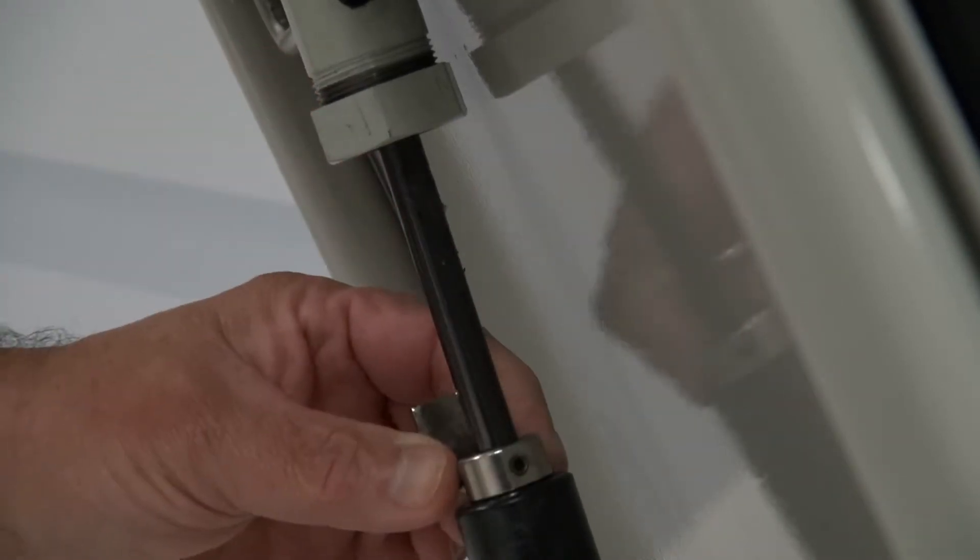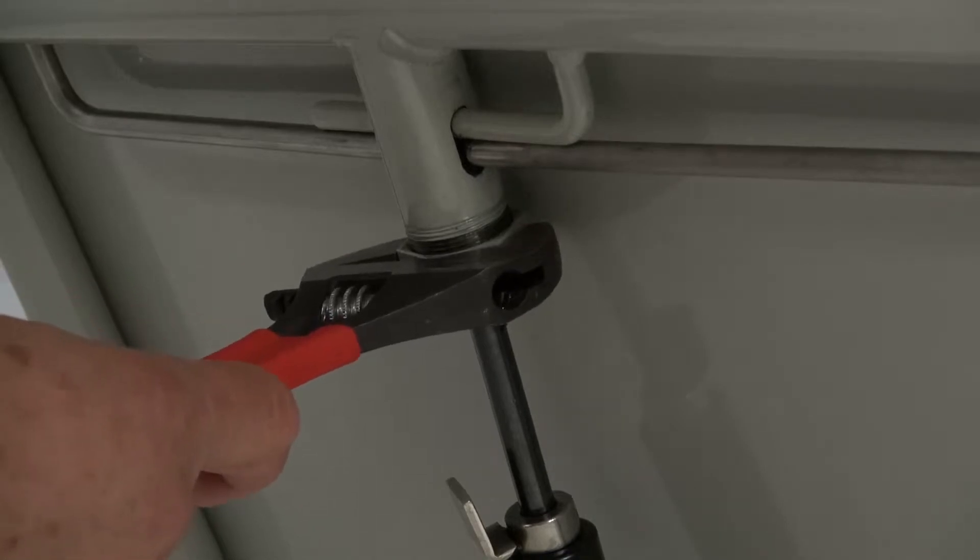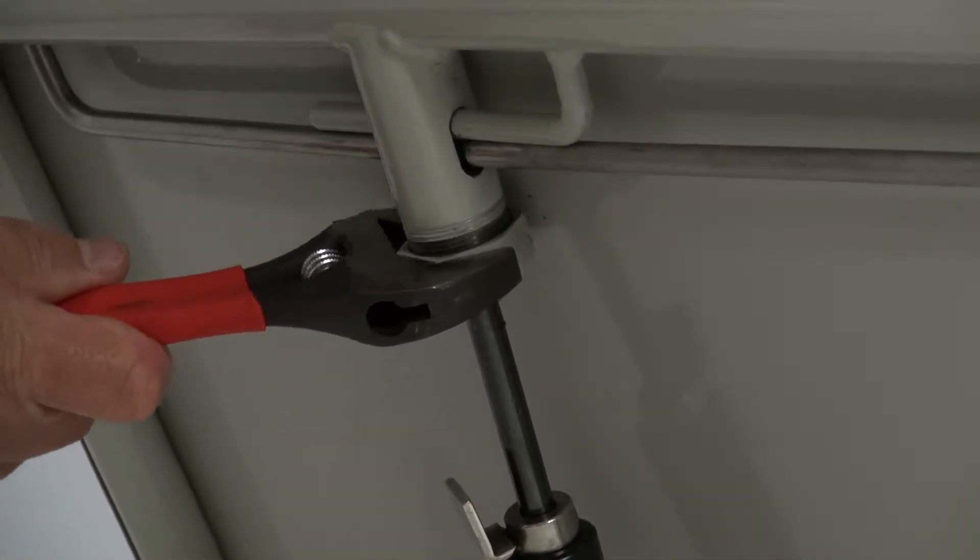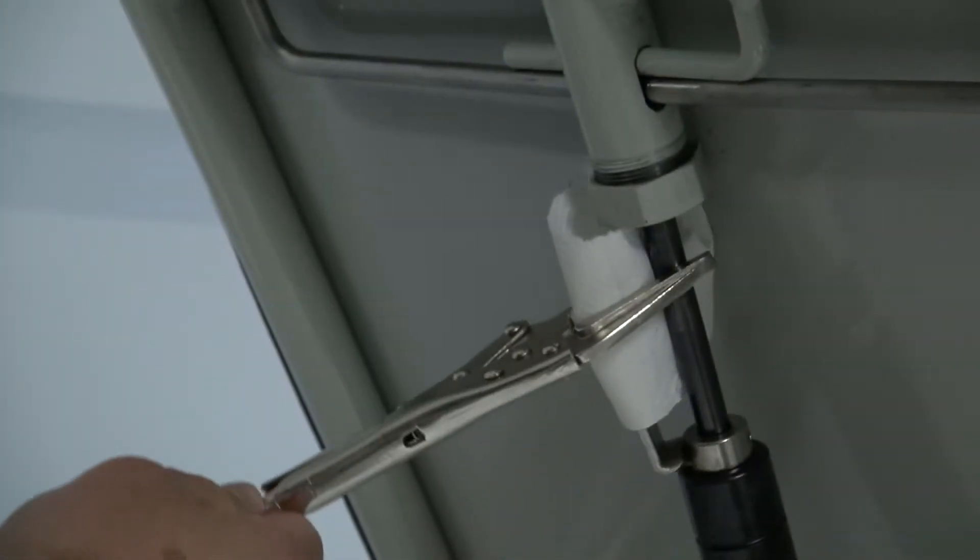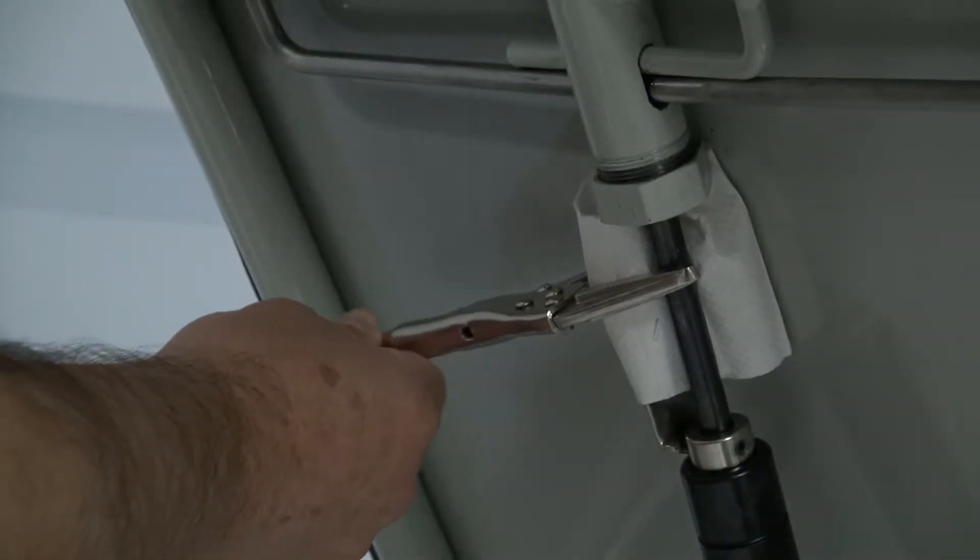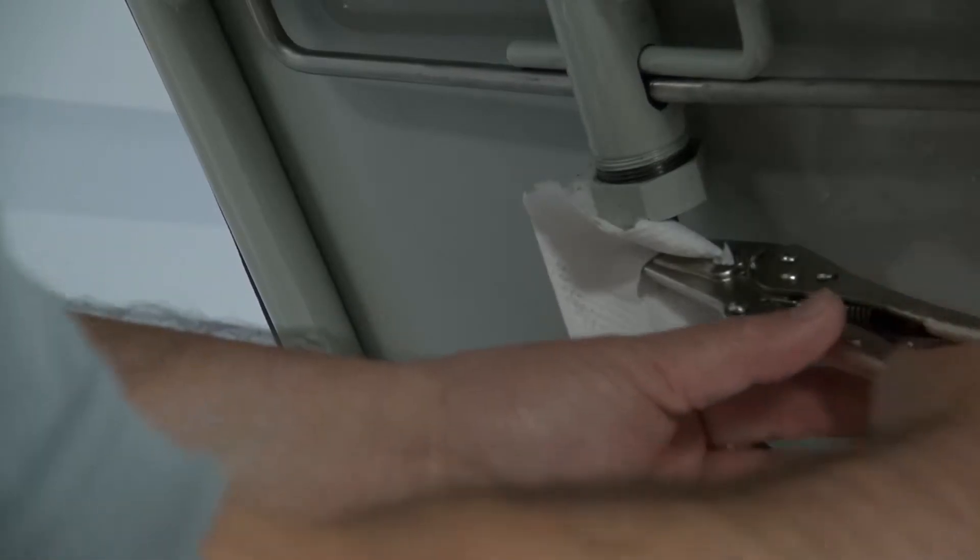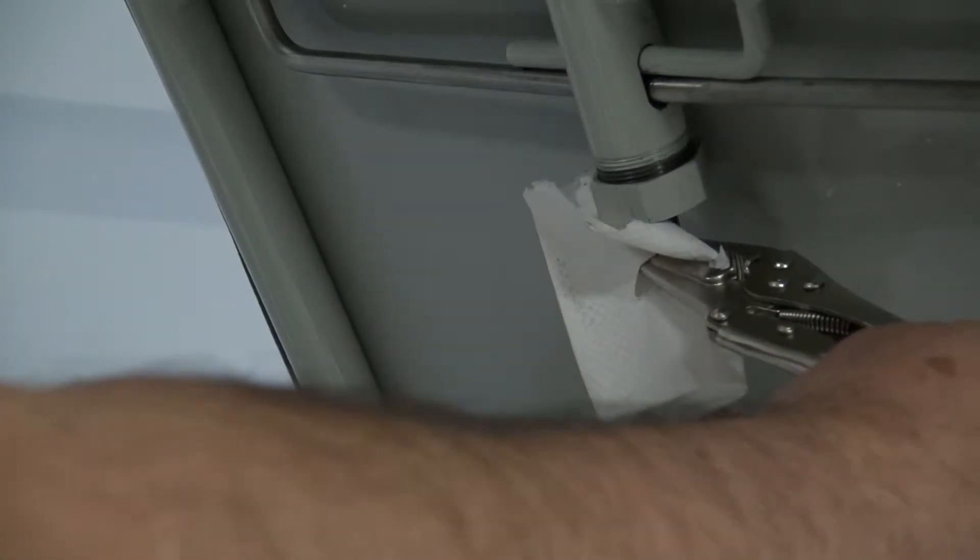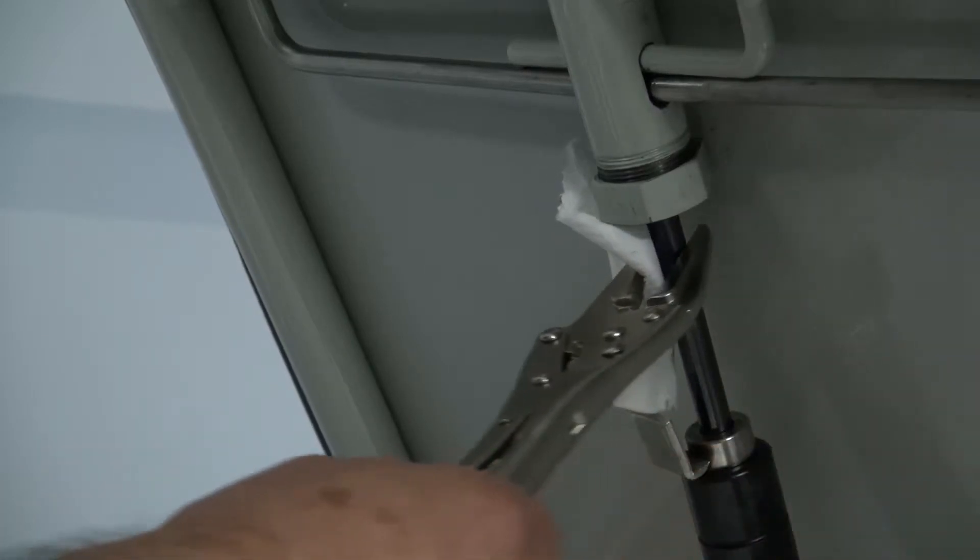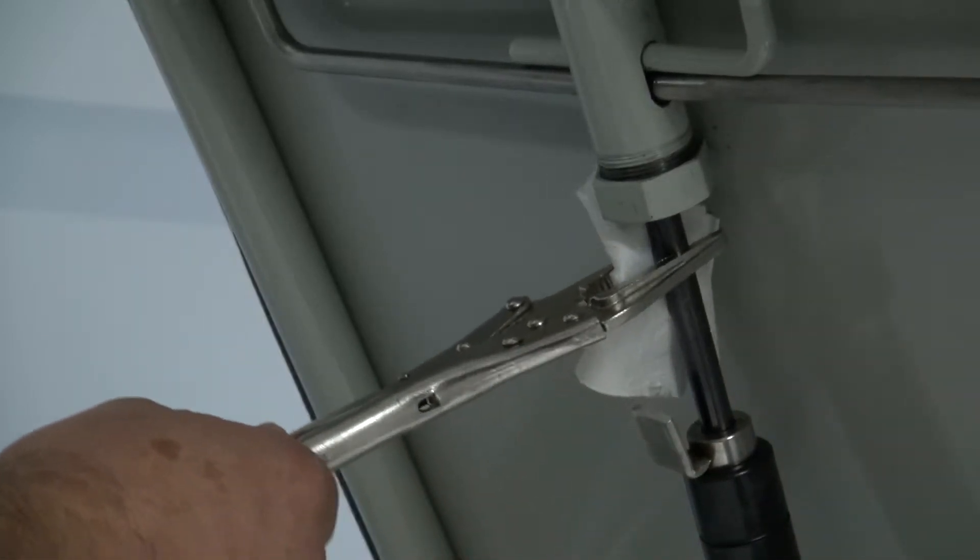Take the crescent wrench and loosen the gas spring nut. Using the vice grips, place a paper towel or cloth over the teeth and clamp the vice grips about a half inch under the threads. Now, turn clockwise to let the pressure off the gas spring. You will need to adjust the vice grips accordingly.